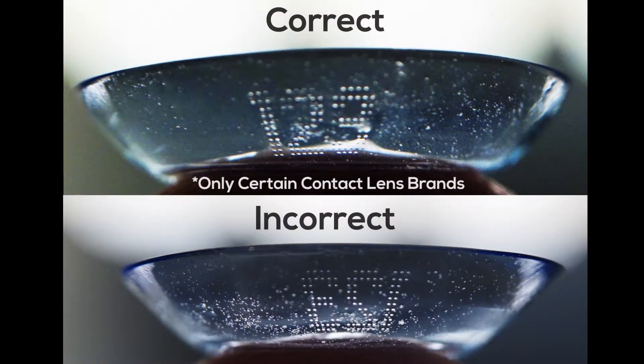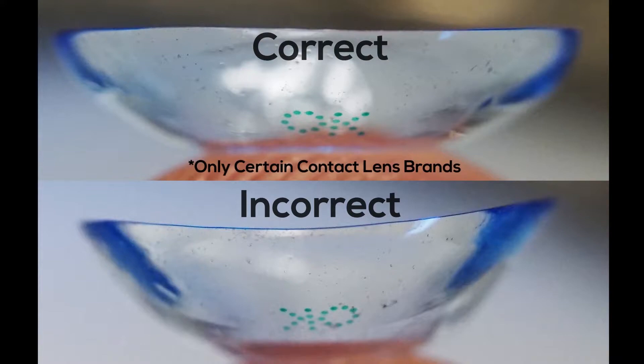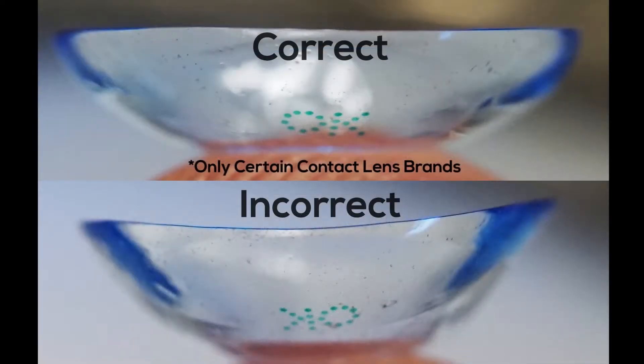Option C: Look for number or branded laser markings on your contact lens. Place the lens on the tip of your finger and look for these markings. If they're backwards, your lens is inside out.